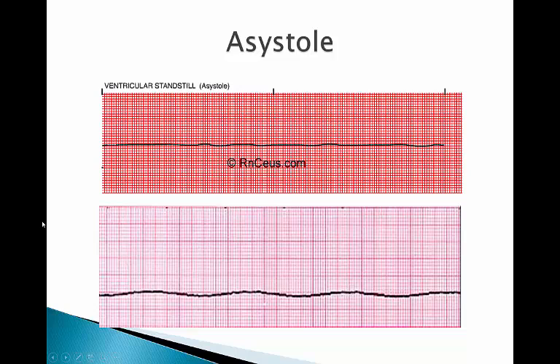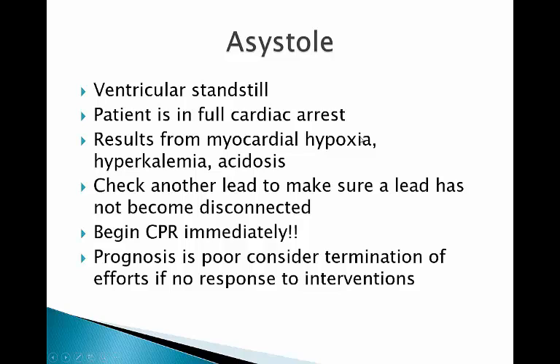And then, of course, the last one is asystole, also known as ventricular standstill. Okay, so that would be your flat line, or that's considered to be a flat line as well. Full cardiac arrest, again, your H's and T's could be in play here. You also want to make sure that you check a pulse, okay? One of the first things that you should do when you have any kind of irregular rhythm, VTach, VFib, asystole, anything like that, is check the patient first.